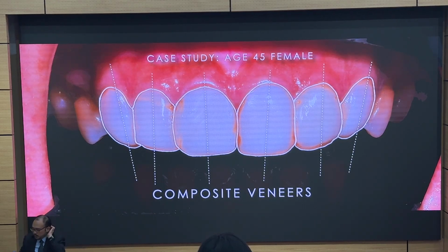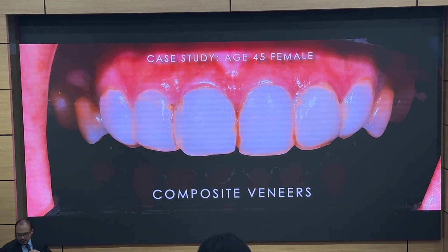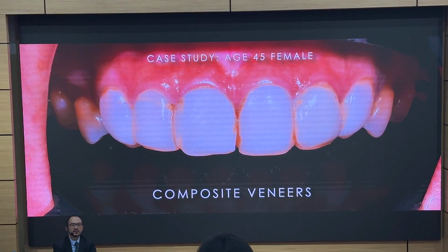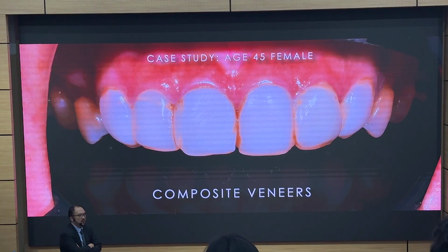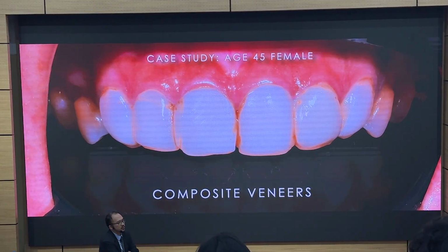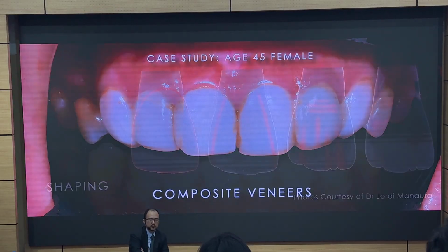Okay? So cases like this make me wonder, alright, how do I even fix this? How do I even address this? The truth is that in cases like this, what we should be focusing on is more on the shape management. Okay?